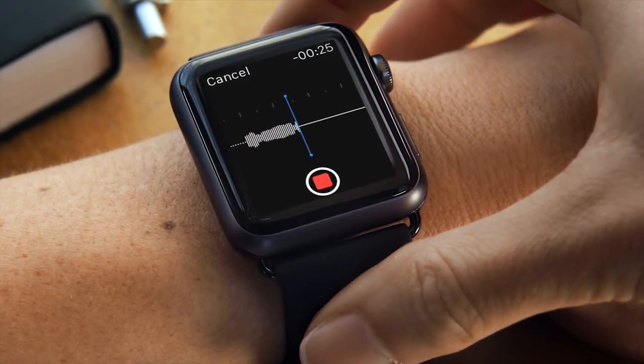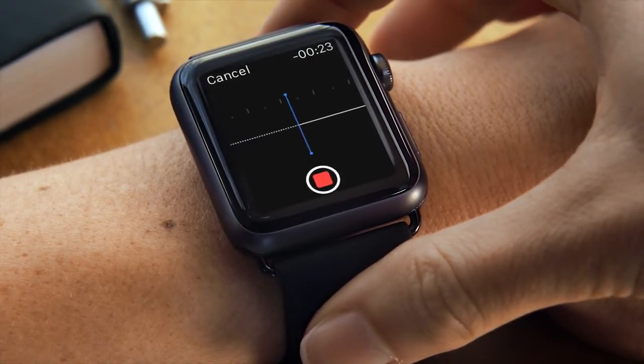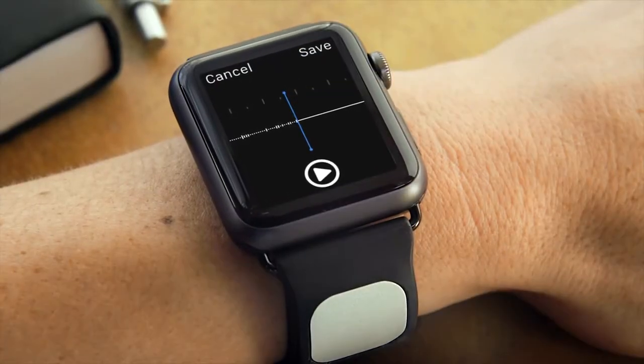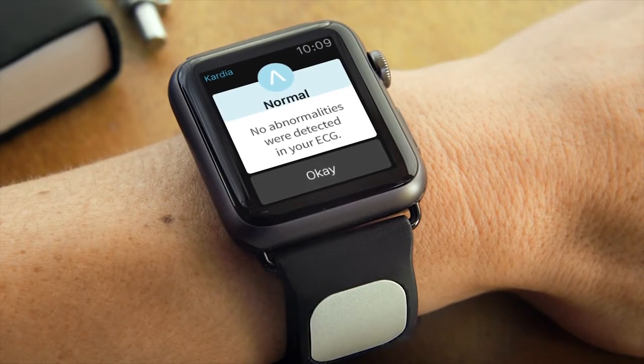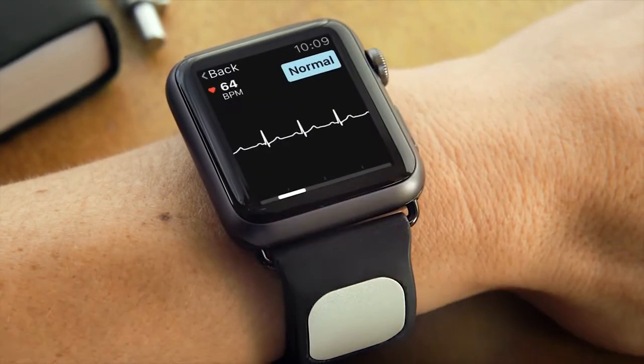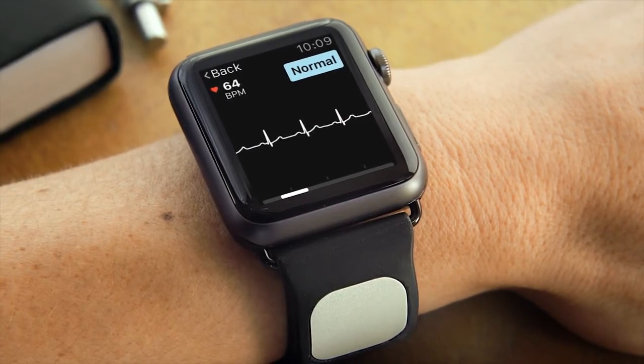I'm feeling tired all the time and having mild palpitations. When you're finished, you can save your results, cancel, or play your voice memo back to make sure you covered everything you want to tell your doctor. And that's it — you just gave yourself a medical-grade EKG.